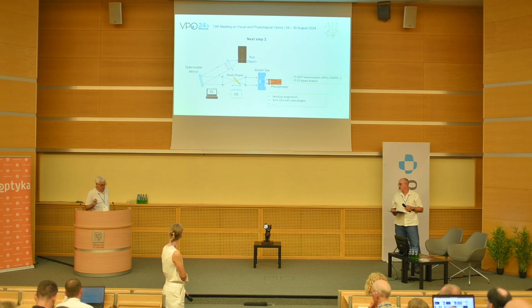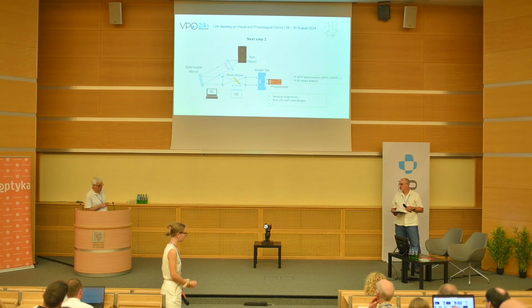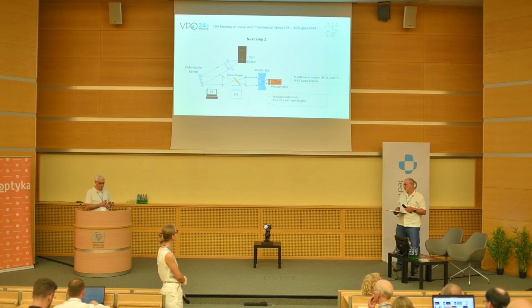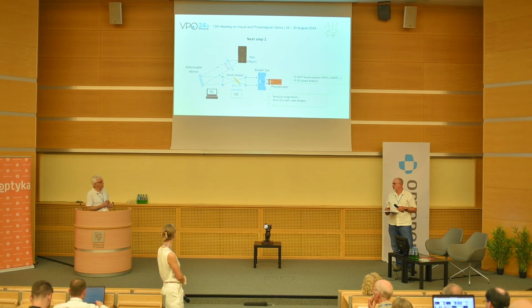No, it's just a practical approximation, because one of the best objects we can have is a cross section with small slits, and it's a practical measurement of the OTF.